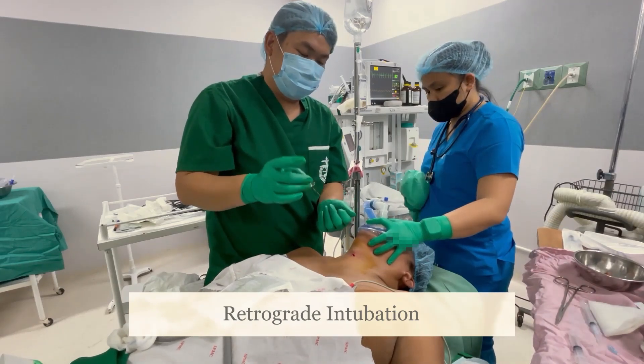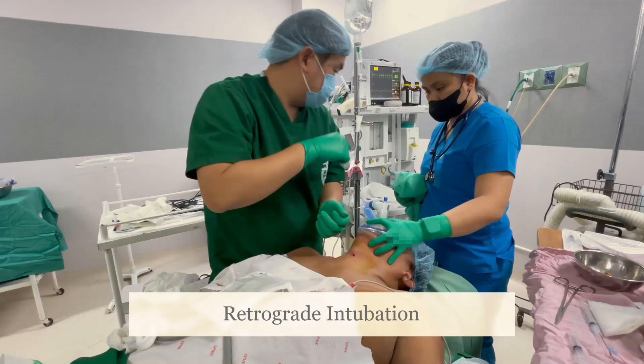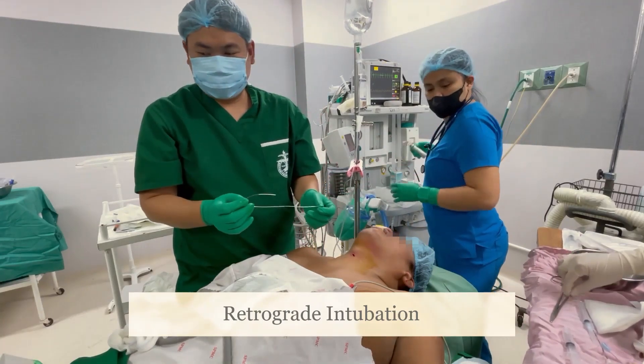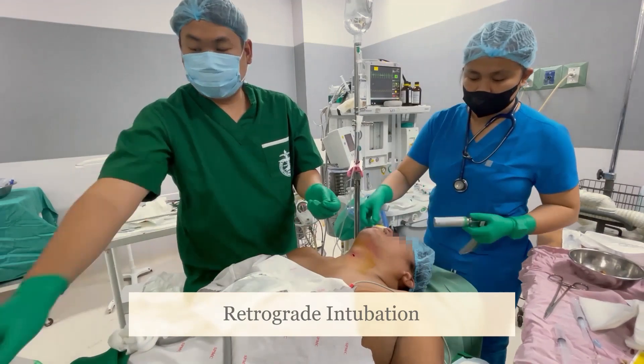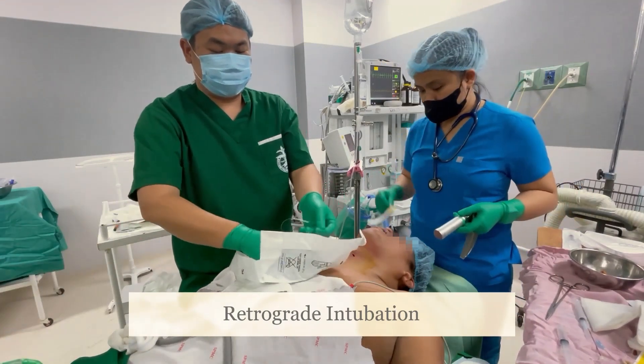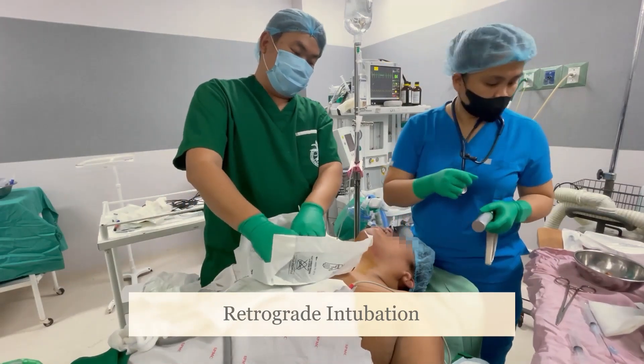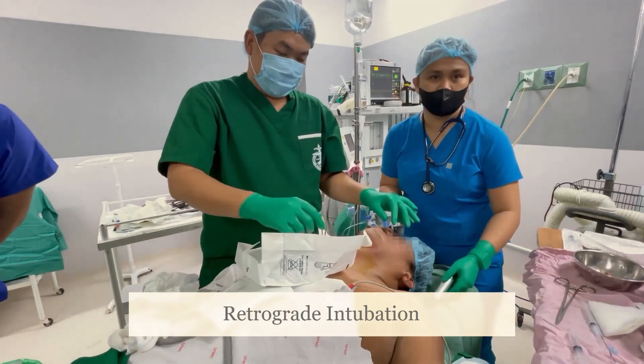If the patient is awake, sometimes they could spit out the catheter. Most of the time, you will need to grab it with a forcep and pull it out. At rare instances like this one, it automatically goes out of the mouth. Remove the Tuohy needle.